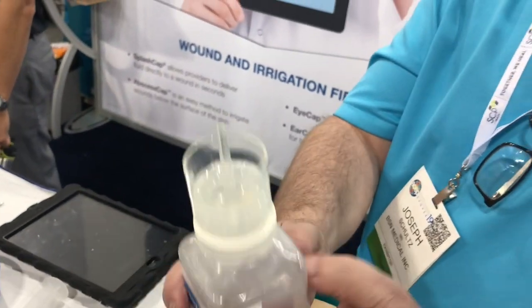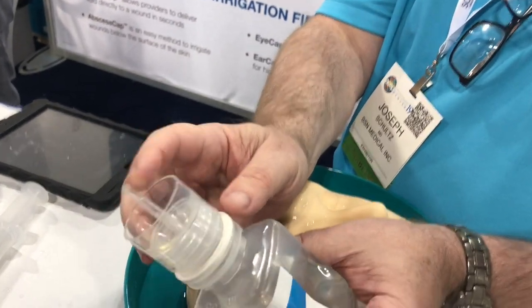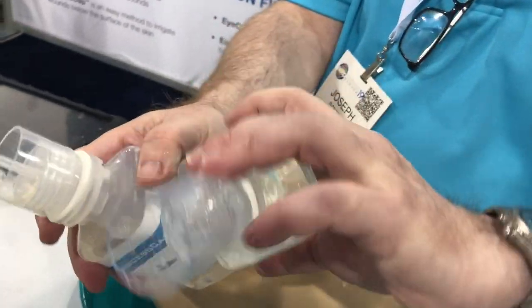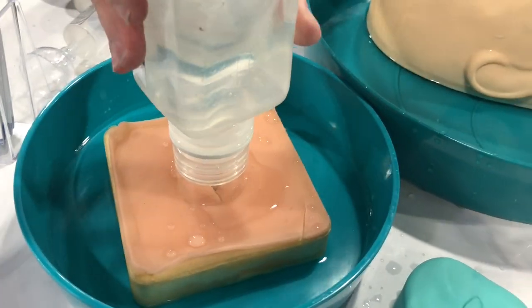There is the new abscess cap. The abscess cap is like the splash cap — it's got a long nozzle — but this one goes beyond the shield as opposed to being recessed within the shield. So instead of doing surface irrigation on the skin, you're going to be able to get deep into the abscess to irrigate from the bottom up.